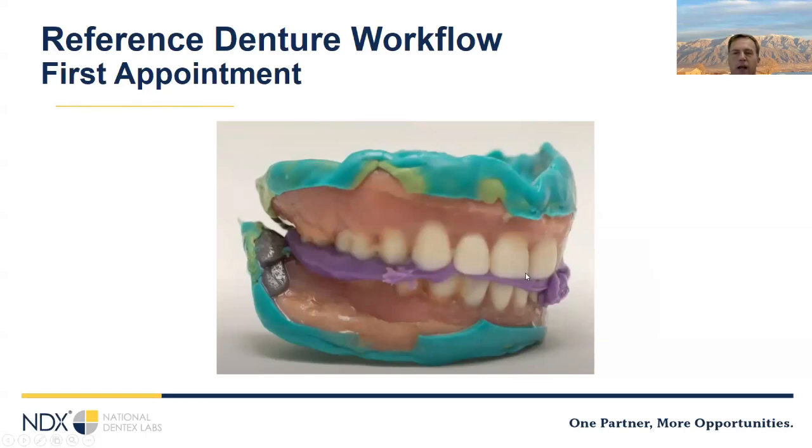And then you can actually do an extraoral scan on this. So for the maxilla, start on the intaglio surface. This is really important. Start on the intaglio surface, scan back and forth, rolling over the borders. And then once you capture that, go over the borders and capture the whole cameo surface. You'll either have to use denture scanning on your settings or turn off AI trimming, depending on what system you're using. So same thing on the mandible, and then you can put them together with the bite, scan the bite.